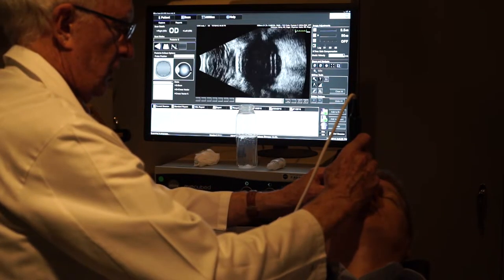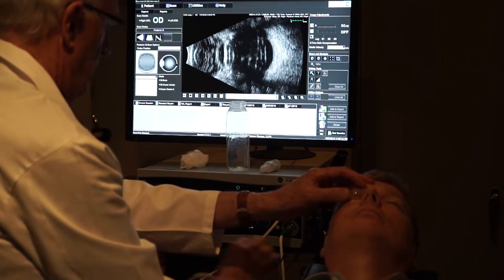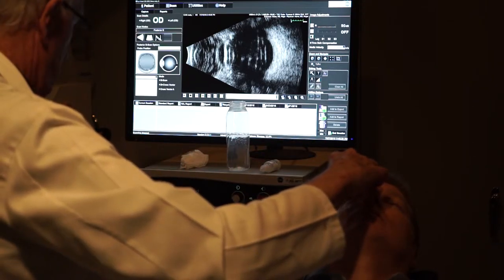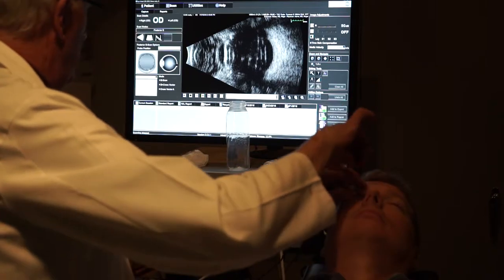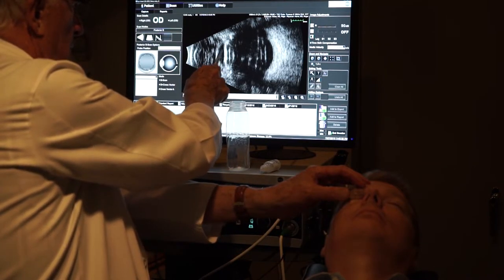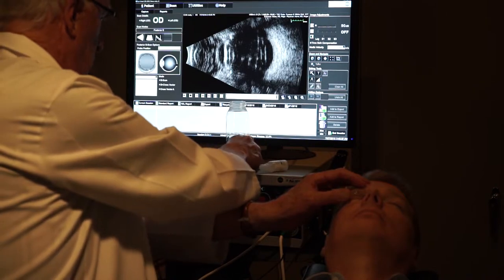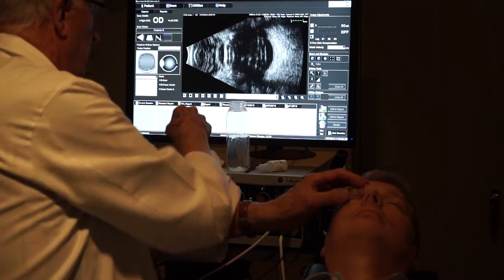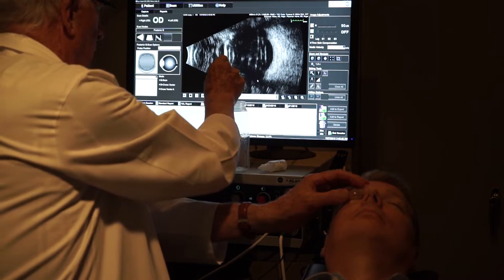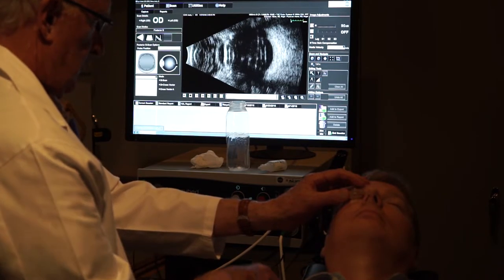Here's an example of the immersion technique. We stand the probe off and can actually see the structures of the eye. The immersion shell is full of fluid up here. Here's the cornea, here's the anterior chamber, here's the iris, and here's the posterior lens — you can see all those structures by backing off the probe. You can also measure axial length, from the cornea to the retina. That's using the 10 megahertz probe, which shows you the entire globe.